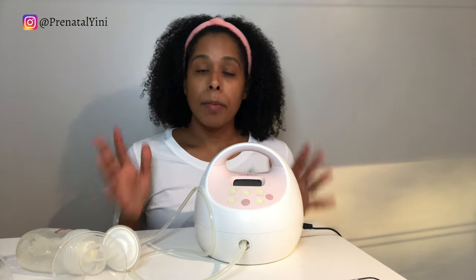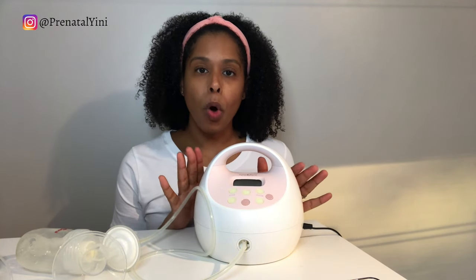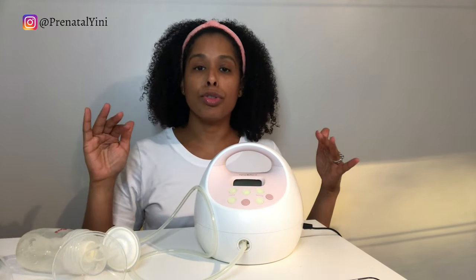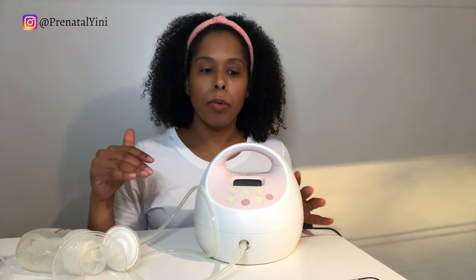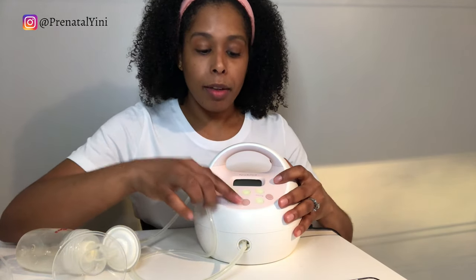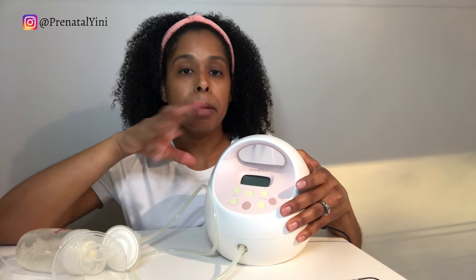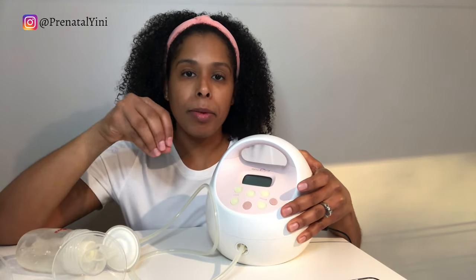Now let's talk about the best settings. Something important to remember: breast pumping is all about hormone stimulation — it's not just about pulling milk out. You need the right settings to stimulate breastfeeding hormones in your bloodstream, which then releases the milk. Research shows that a breastfed baby typically cycles at around 40 to 60 cycles per minute, so that's what we want to mimic with the breast pump.